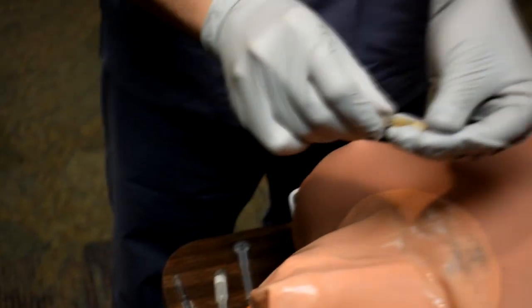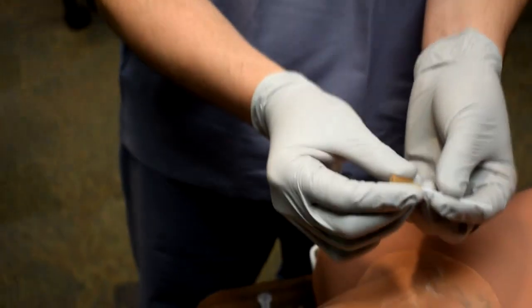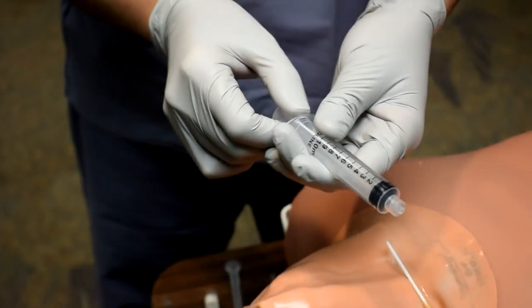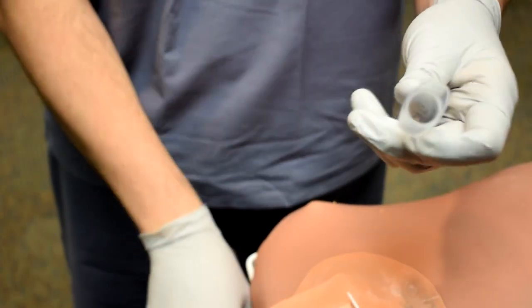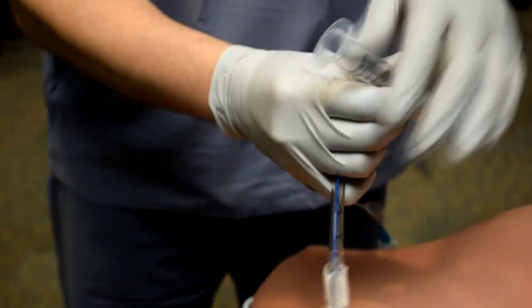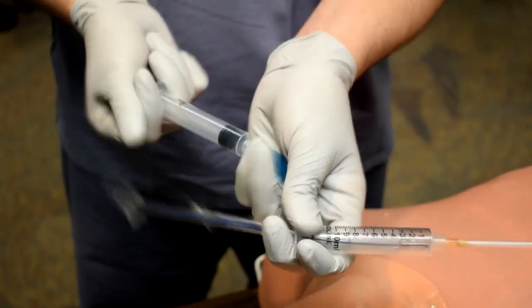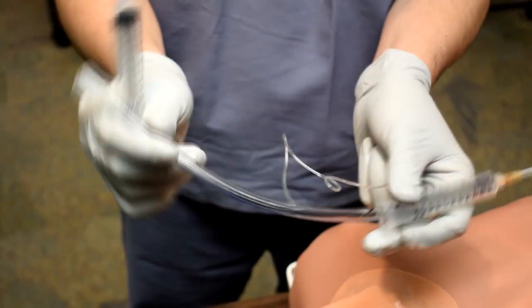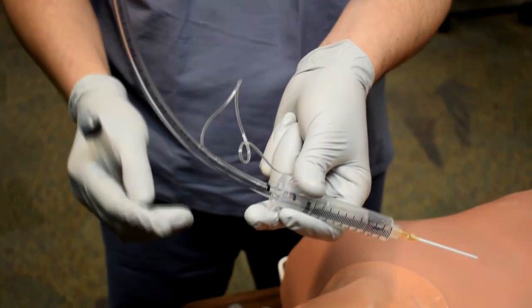Now once you have the angiocath in the airway, what do you do? Because you can't attach this to anything, and as we said, we want to learn how to do this without a jet ventilator. So we're going to have this inside the airway, and basically we can take a syringe. Here we have a 10 cc syringe, but you could use a 5, a 10, or a 20. If you pull out the plunger and attach the syringe to the angiocath, then you can take your endotracheal tube and put it into the syringe, and then you can inflate the cuff. Then you have your endotracheal tube in the syringe, and then you have your angiocath, and then you can attach this to a BVM so that you can at least start with getting some oxygenation in this emergency in the needle cric.